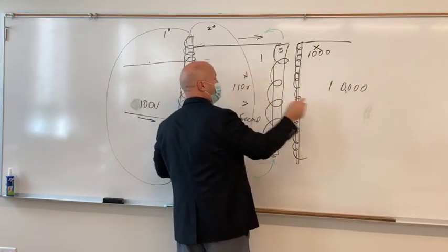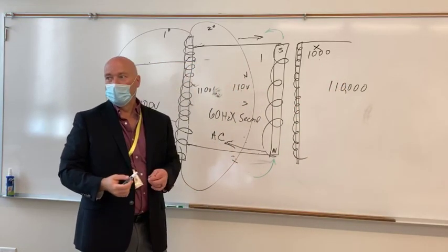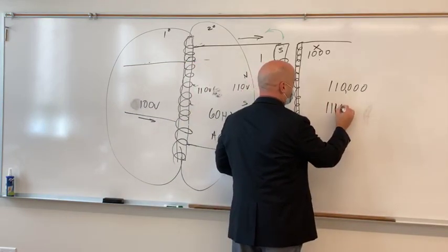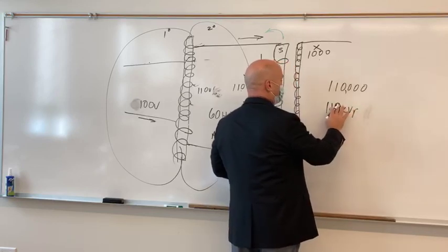So my 110 volts becomes 110,000 volts. Okay? So what is 110,000 volts? That's 110 kVp. So what are you doing now?